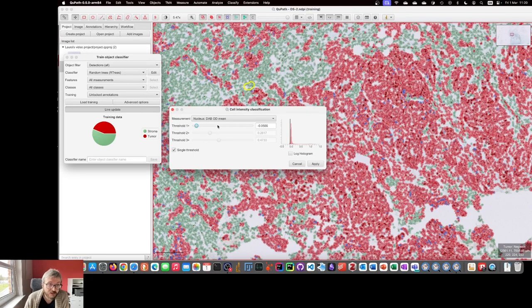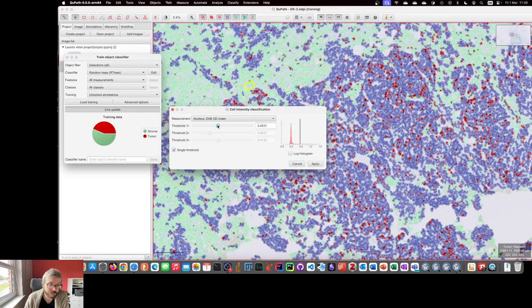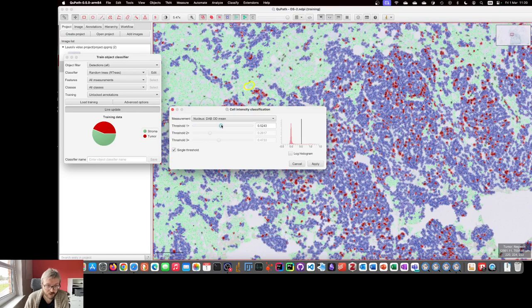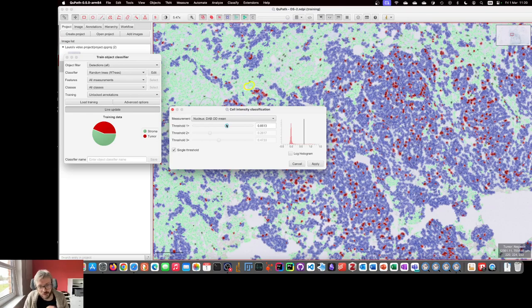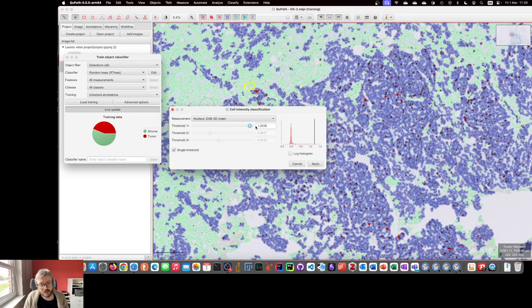The reason for having this as a modal dialogue within QPath is that it creates a clear separation between the time before you start setting the intensity classification and the time afterwards.